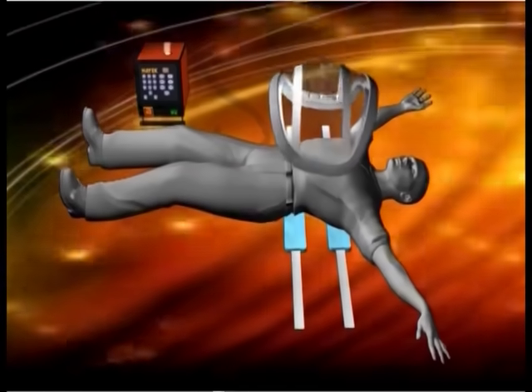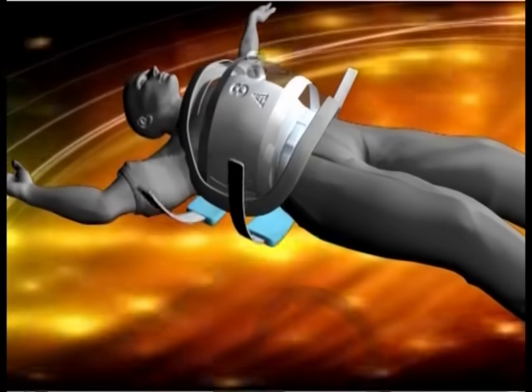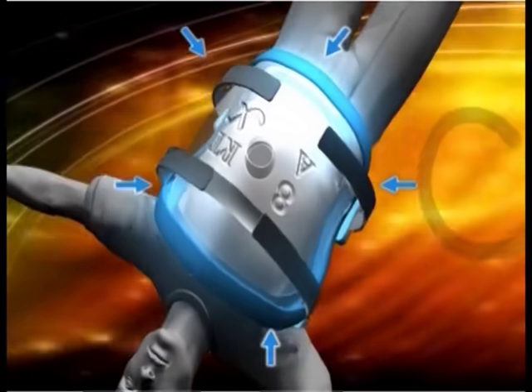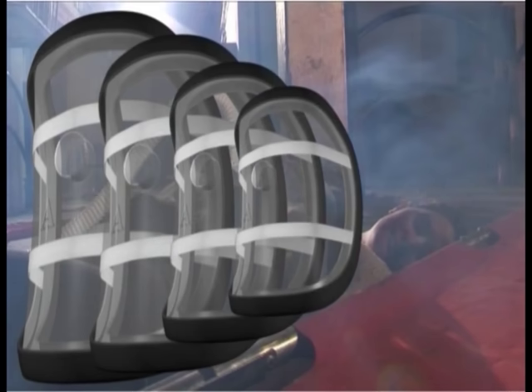The cuirass is applied to the patient's chest. It has a disposable seal, allowing for a comfortable but airtight fit. The flexible, transparent plastic cuirass is available in 11 sizes, chosen according to patient weight and body size, fitting anyone from babies to adults.